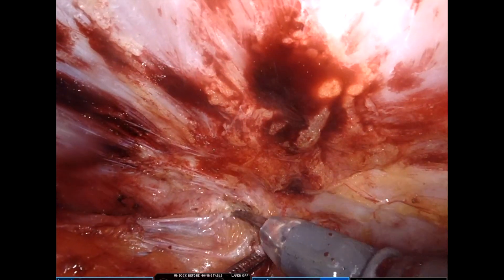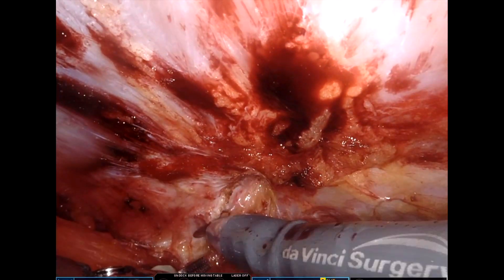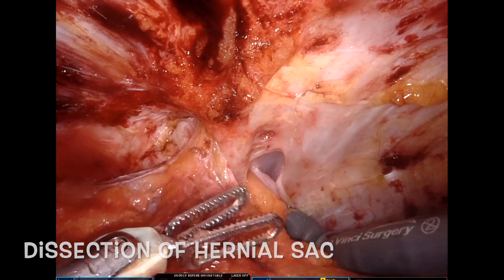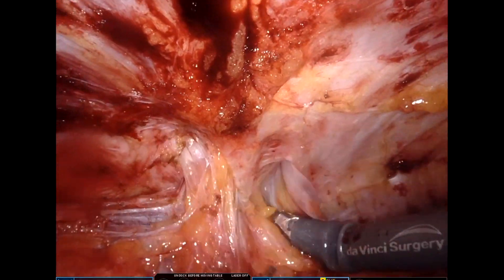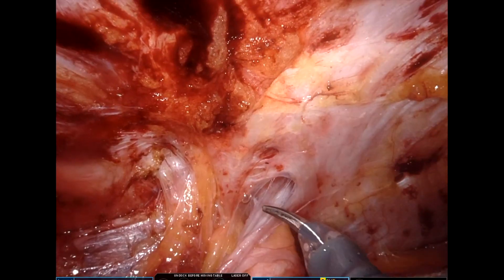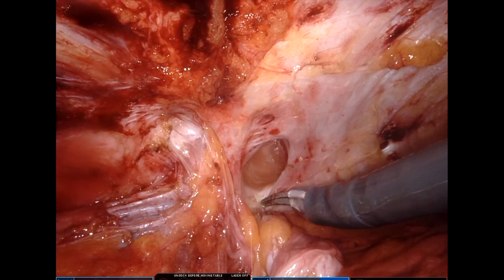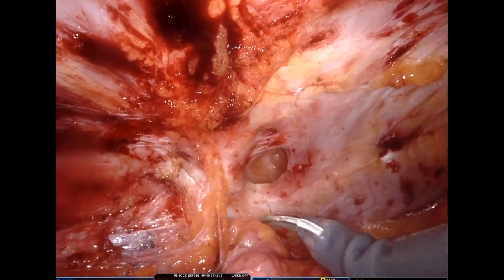When we start working near the umbilical hernial defect and reduce the hernial sac, we need to be careful that we do not cause any injury to the umbilical skin, and the role of the bedside assistant is crucial here. Now we are dealing with the supra-umbilical hernial sac and we try to bring down the hernial sac intact whenever possible. After defining the boundary of the supra-umbilical hernia, we then deal with the umbilical area.